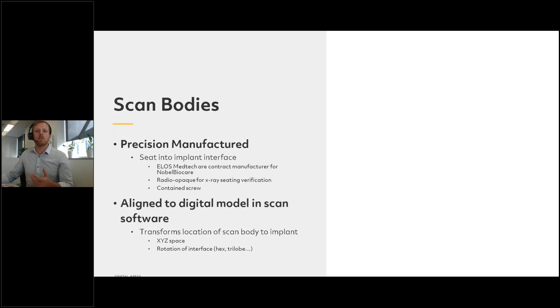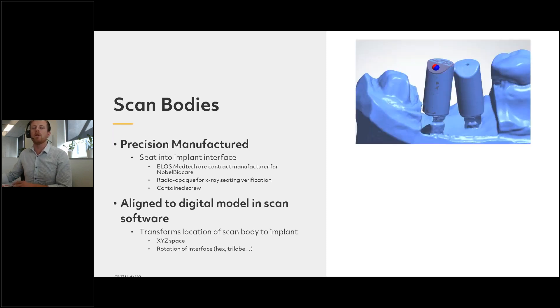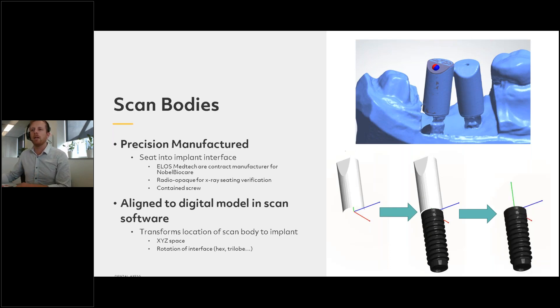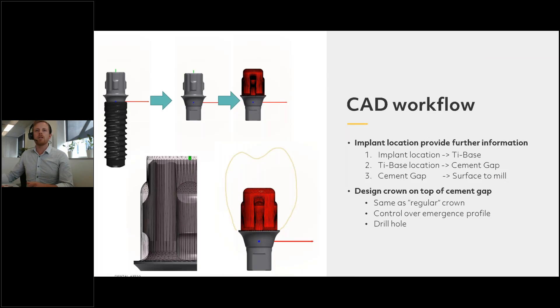So how do we use them? Once we've scanned them, we align the physical scan with our digital model of the same scan body — you can see the purple scan body digital file aligns with the blue scan very well. Once we know the location of the scan body in XYZ space, this tells us where the scan body is relative to the implant — not just XYZ space but rotations as well. Then once we know the implant location in XYZ space, we can design the restoration on top. This tells us where the tie base is.